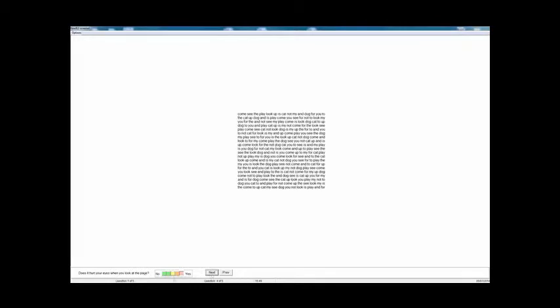I'm going to stick with words in the first arrangement. You can also put up text as well. At the bottom of the screen it says: do the words appear to move, wobble or flicker? And you try and gauge the severity of the client or patient's symptoms on a scale of no to yes. This is very subjective. Let's say the patient says the symptoms are quite marked. Do the words look too close together? Sort of. Does the page look too bright or dazzling? Definitely yes. Does it hurt your eyes? Not really. You can then enter any other comments that the patient might make about those symptoms. That's the first part of the test done — you can see symptoms now has a tick next to it.